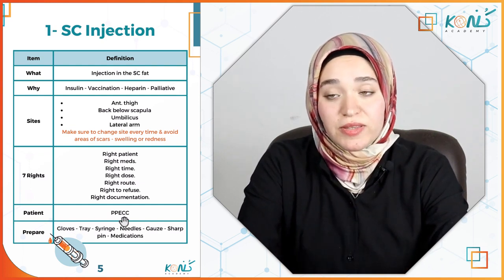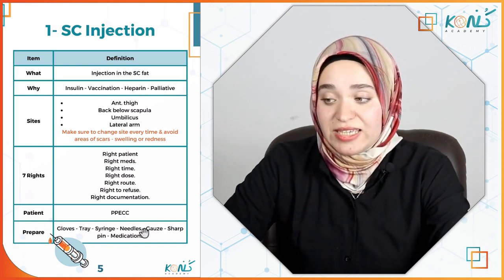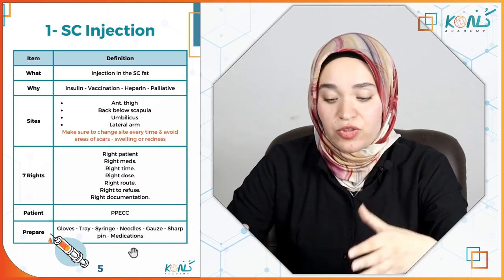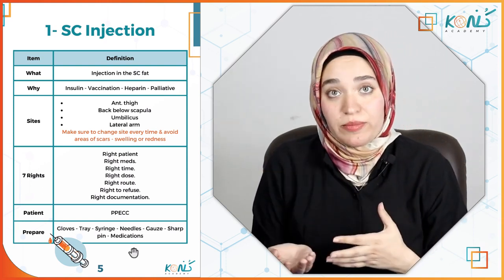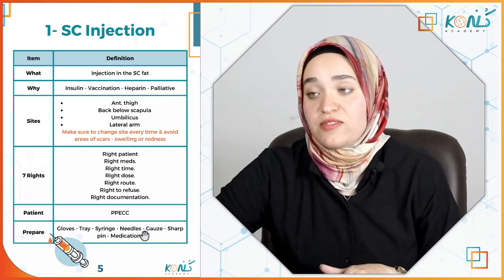Then prepare your equipment, like you need gloves, tray, syringe, needles, gauze, sharps bin, and medication. Okay, you will collect your tools, and then you will go to a mannequin to show him how to insert and how to inject subcutaneously.